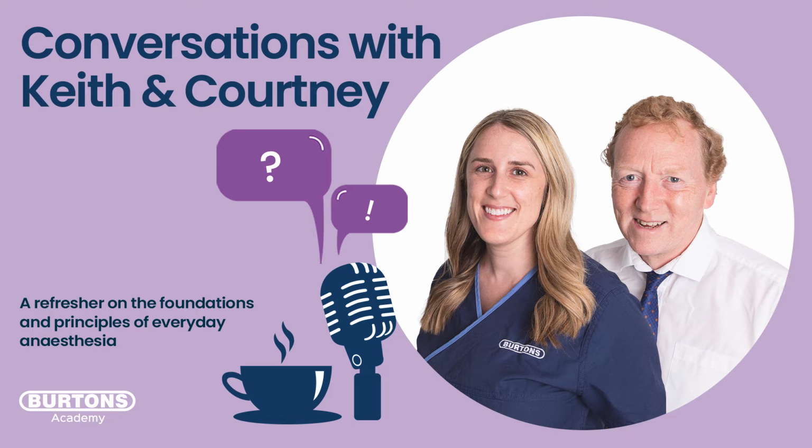And I guess in those patients with profound bleeding, just because the blood isn't arriving at the lungs to be exhaled doesn't mean the production has changed within the body. It just doesn't have a means to get to the lungs to be exhaled. If you've got a reduction in cardiac output, that's correct. The production will remain the same if there's a bleed. And with a bitch spay bleed, you wouldn't see a change in the end-tidal CO2 until it became severely hypovolemic, but a lot of other things would happen before that.